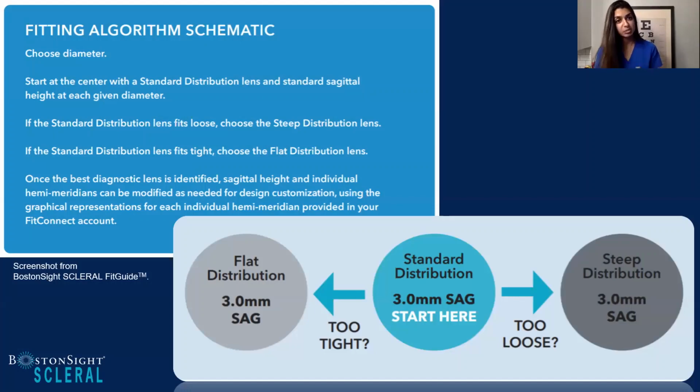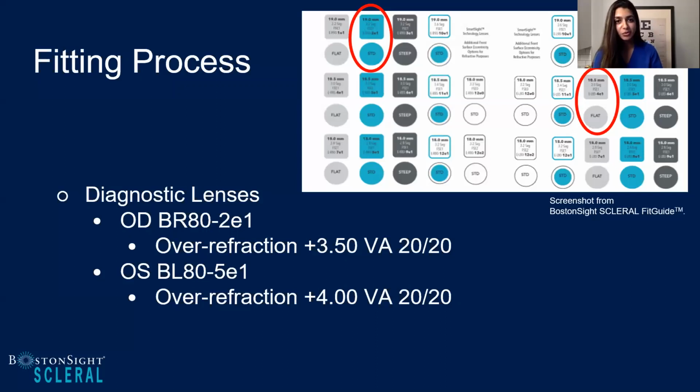So with this patient, I fit her with both the right and the left side. If we move on, actually, Shalu, to the next page, what we can see is I chose two different lenses in the end. For her right eye, I went to a little lower sagittal height. For her left eye, I stuck with my standard lens. And with an over refraction, she was 20/20 and very happy.